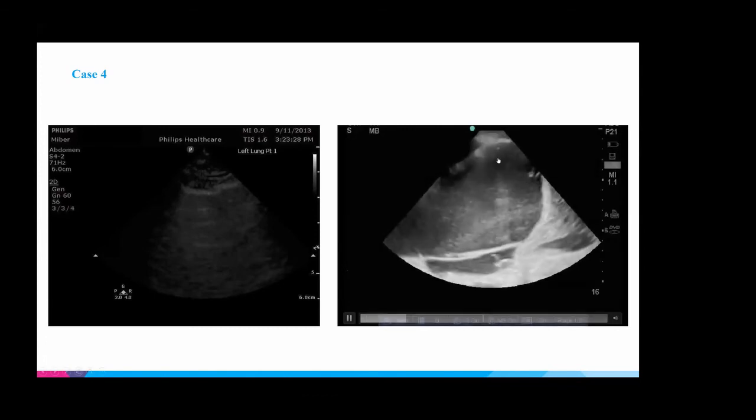Where you can see some anechoic black up top, right? And then as you get deeper, there's movement of stuff. I don't know if this is debris, but there's a gradient, right? Where you have black to dark gray to lighter gray towards the bottom. Yeah, so when you see this, this is a hemothorax. Yep, this is a hematocrit sign, yep.